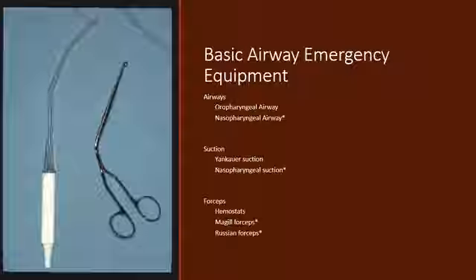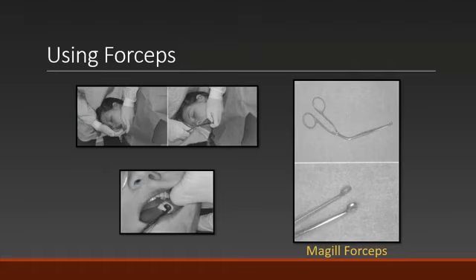But all these forceps have serrations on the end to allow you to be able to grab and grasp things to remove them from the mouth or the back of the throat. And that's really what we want. We want to have something with serrations so that we can grab a tooth if it falls back there and be able to retrieve it very easily.